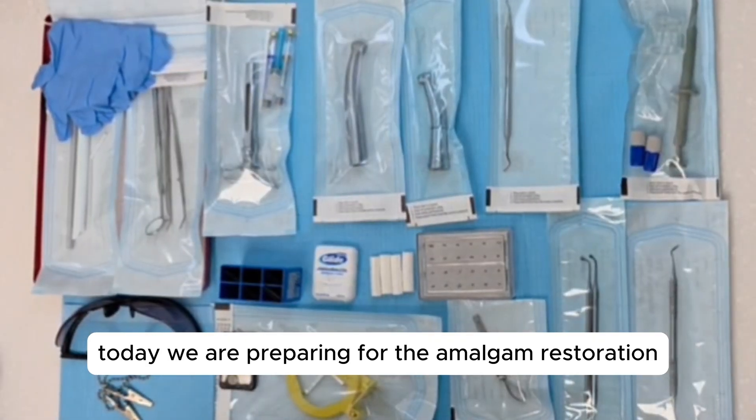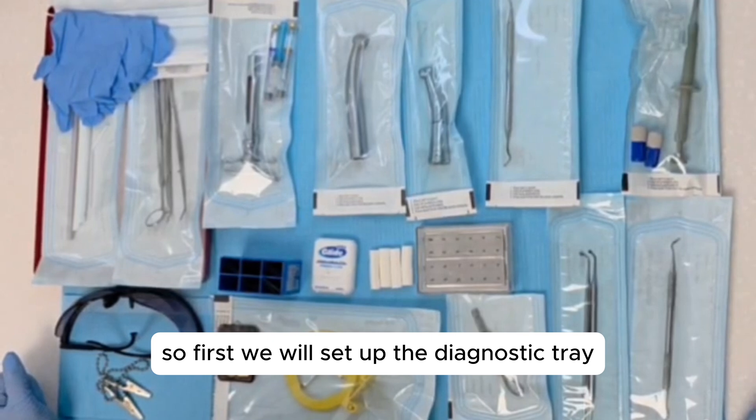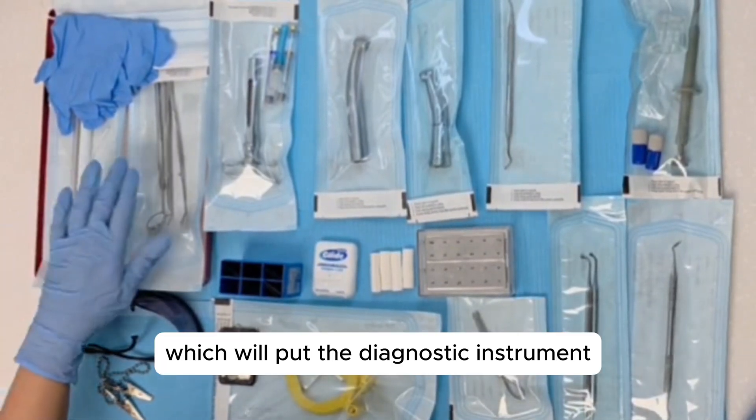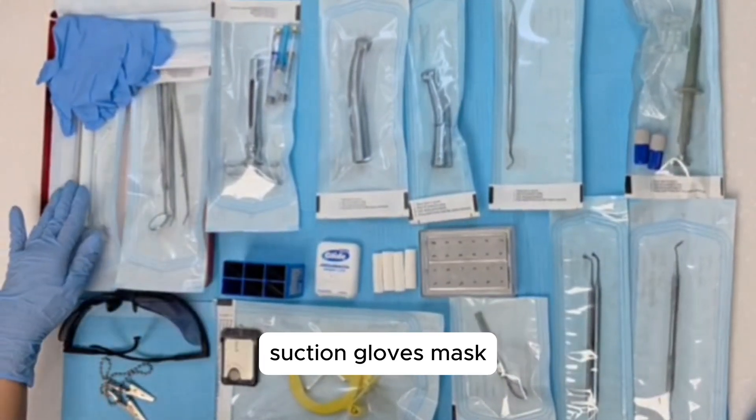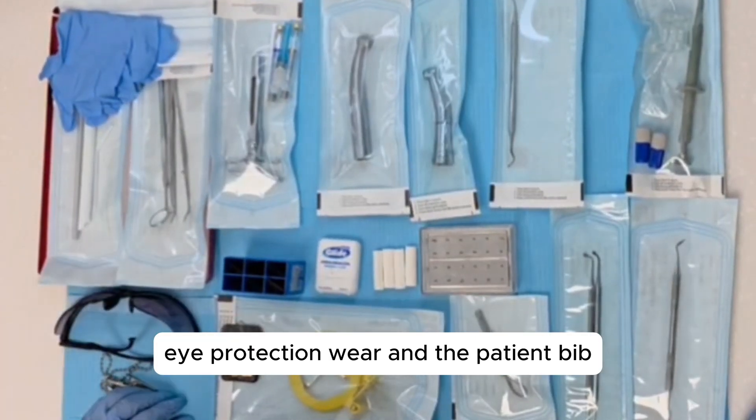Today we are preparing for the amalgam restoration. First we will set up the diagnostic tray, which will include the diagnostic instruments, suction, gloves, mask, eye protection wear, and the patient bib.